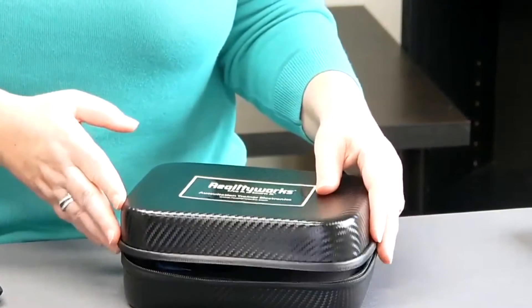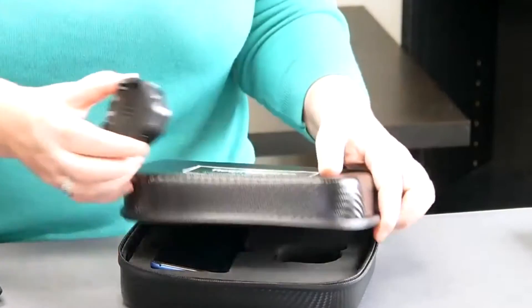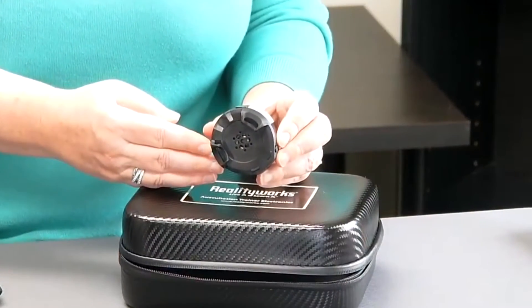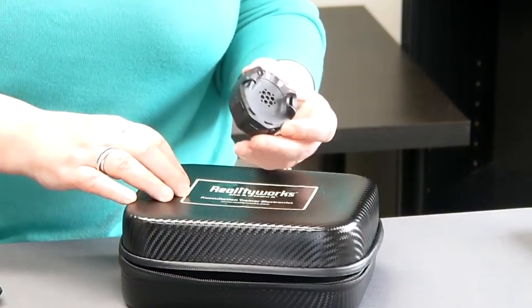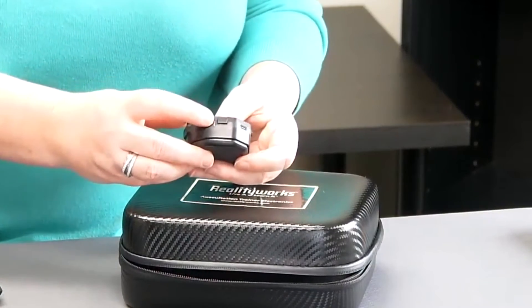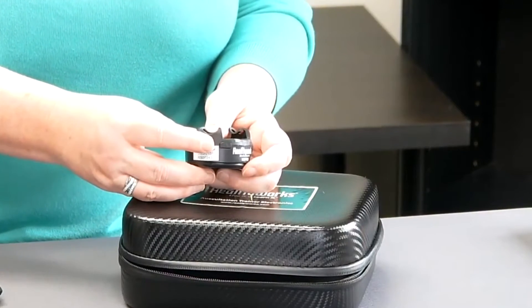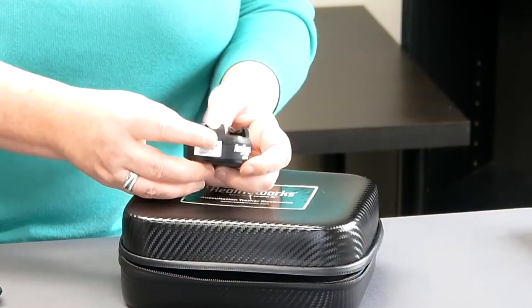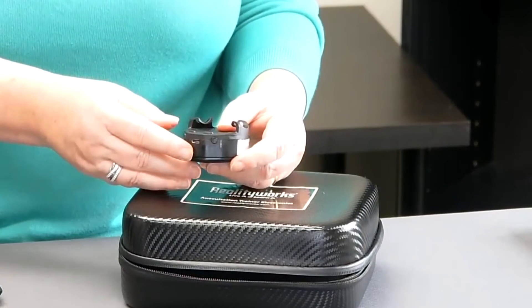The auscultation trainer comes with a reality scope and a smart device. The reality scope is a Bluetooth attachment that fits on any stethoscope that you already have. There's a power button, an audio boost button if you'd like to make the sounds louder, and a Bluetooth connection that links the reality scope with the provided tablet.